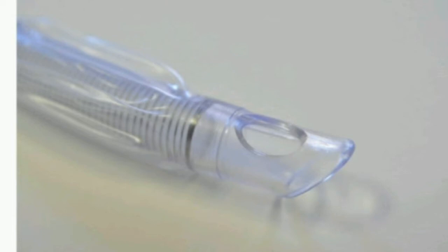The fact that this type of ET tube contains a metal wire coil means there is no need for a radio-opaque line.